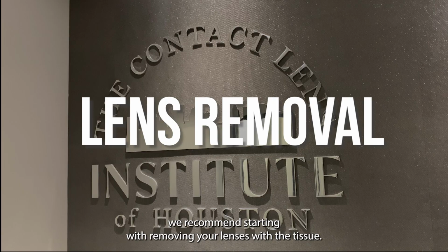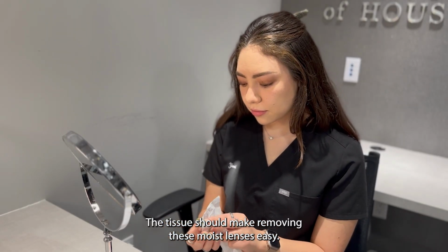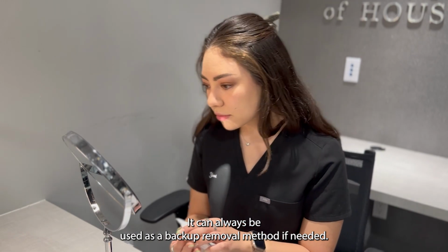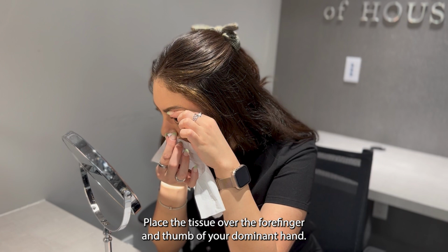For new hybrid wearers, we recommend starting with removing your lenses with a tissue. The tissue should make removing these moist lenses easy and can always be used as a backup removal method if needed. Place the tissue over the forefinger and thumb of your dominant hand.